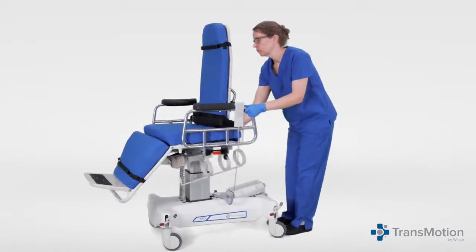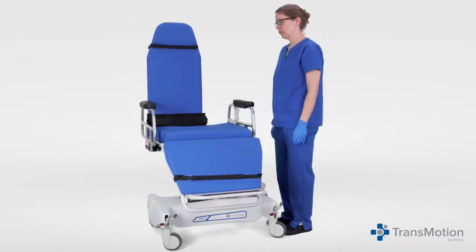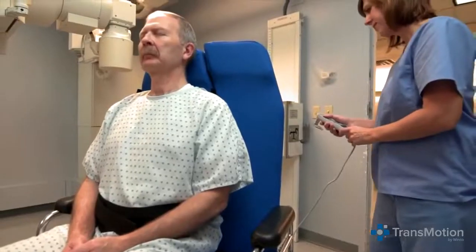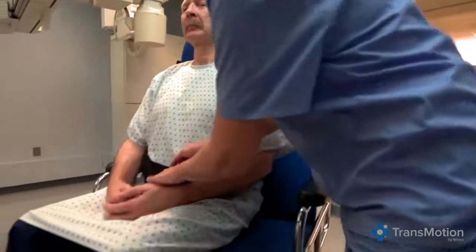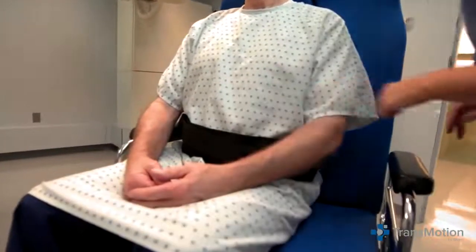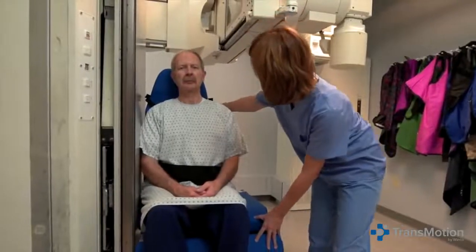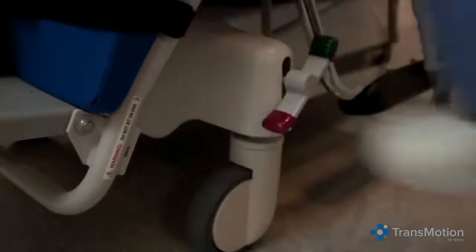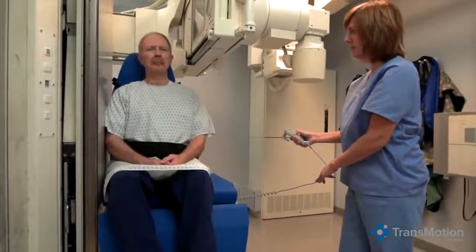The TMM3's 90-degree rotating seat lets you easily take both lateral and anterior-posterior images. Make sure the patient is in the full upright position and belts are secured. For the lateral view, lower the side rails. Roll the chair into the RF tower, lock the brakes, and use the pendant to position the patient at the appropriate height. Now you're ready for the lateral view.